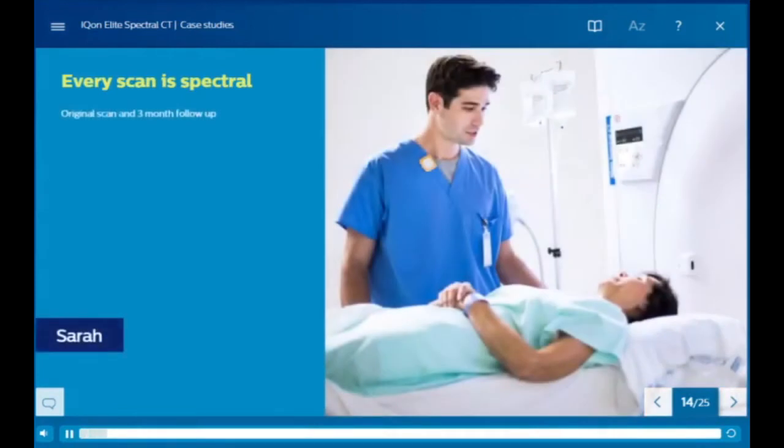Sarah comes to the hospital for a follow-up session. She has been treated for chondrosarcoma, and after chemo or radiation treatment, she was advised a chest, abdomen, and pelvis scan. The scan was done as a routine follow-up. The reports showed a suspicious staining in the left axillary region. Reviewing of the low mono-E showed an enhancing lesion.